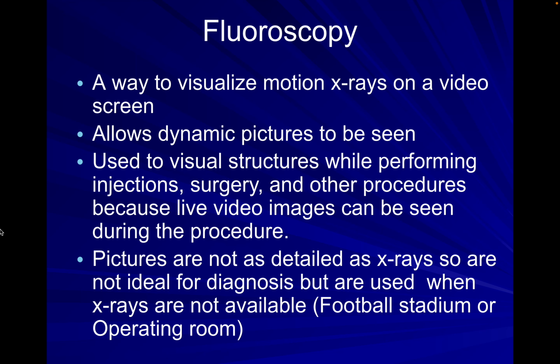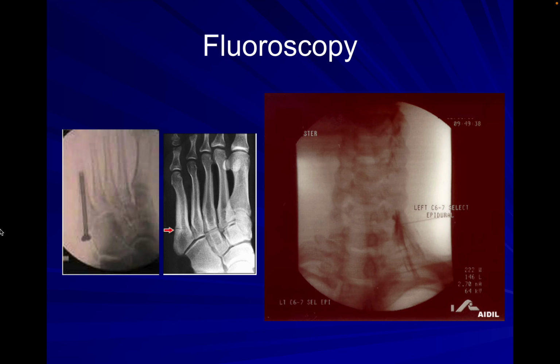And this can be really helpful in places like the operating room or in a football stadium, because you might not have a formal X-ray machine available, but you might have access to fluoroscopy.